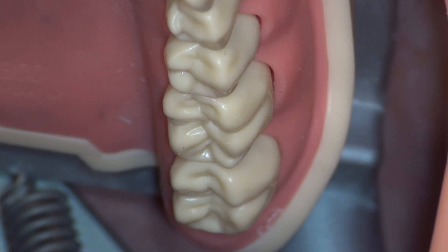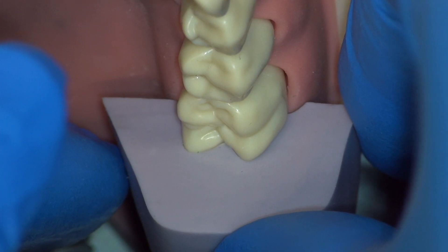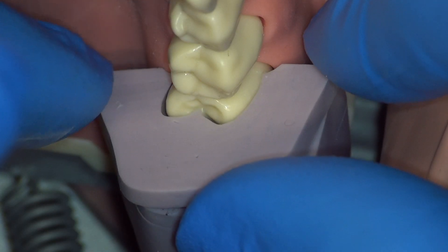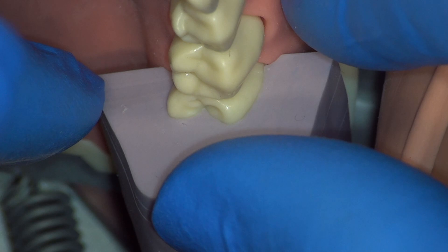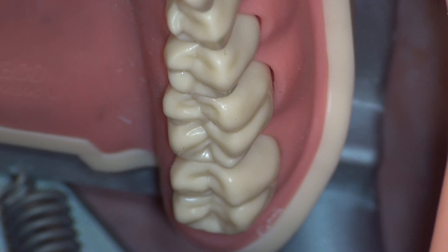Hi, I'm Dr. Fritz Mora. Today we're going to be preparing tooth number 30 for a complete cast crown. Before we begin preparation, we must ensure that our putty reduction guide fits perfectly on the tooth surface. To see the making of a perfect putty guide, reference my video on ACC30.